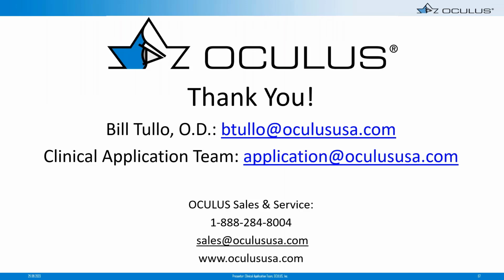I'm going to add to that where, depending on patient facial anatomy, in positioning the cornea at the widest aperture point of the lids, because I'll find even when scanning kids, for some reason they position their head oddly, and with the headrest their cornea is completely shoved into the corner of their eye. So being able to look at your iris image and see in that live window where the cornea is sitting, or the iris I should say, and get it to the widest aperture point that you can naturally as well.